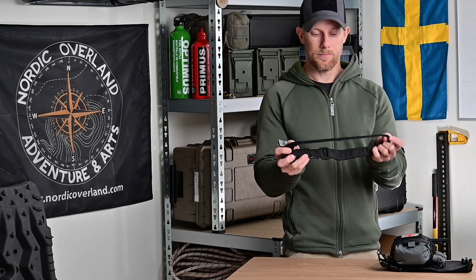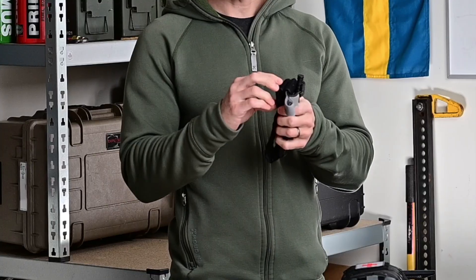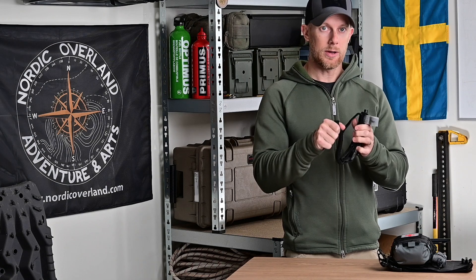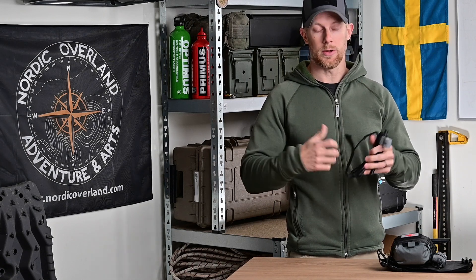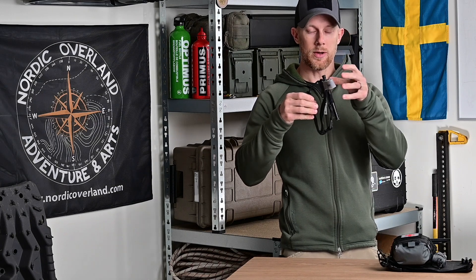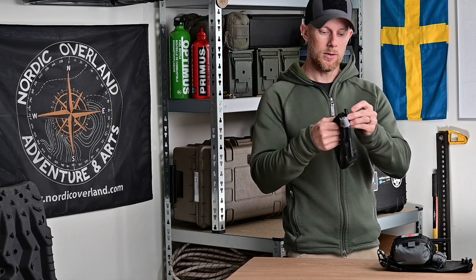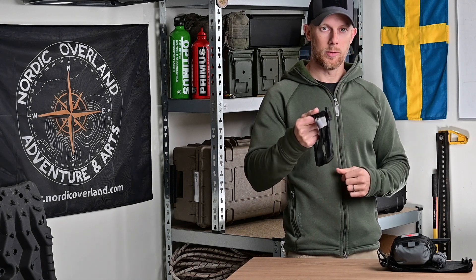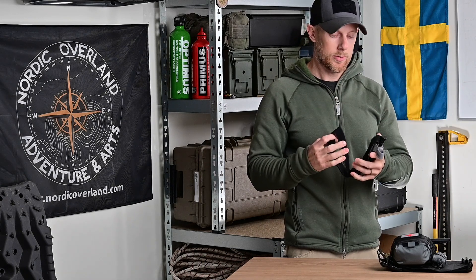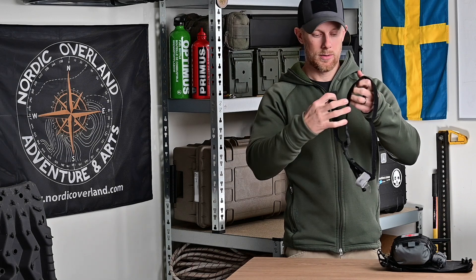Tonikén bärs vikt ungefär en tredjedel med den lösa änden och därefter dubbelvikt. Man kan vika in den yttre lite hårdare delen av flärpen och anpassa längden för att få ett bättre grepp med handskar. Ett litet tips är att greppa den andra öglan – den som är motsatt öglan där plastveven och plastbeslaget sitter – se till att den tyngsta delen är riktad uppåt och sedan slå ut tonikén, vilket gör att man direkt kan trä i armen.